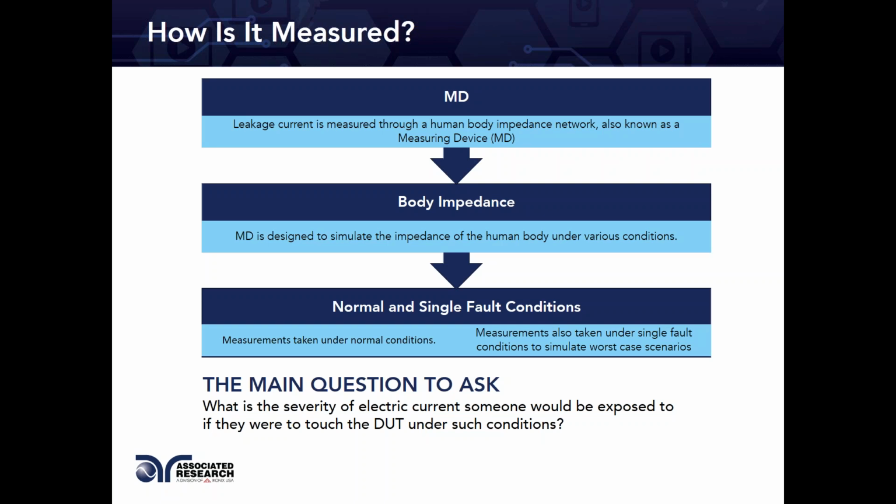Then we go into fault conditions. So we have our network that we want to measure, and we have the product that the leakage current is going to come from. Now we want to be able to simulate some conditions. So what are these conditions?